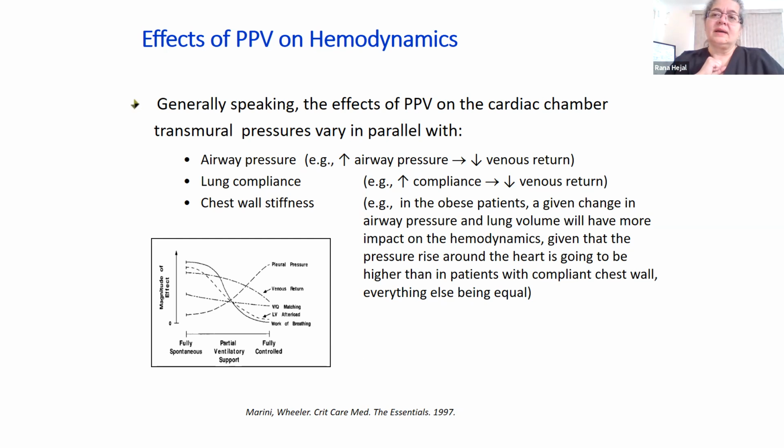Either they are feeling short of breath because the tube is in there and they are partially obstructed from it and they just are sighing constantly. So you want to take that out fast, and it's immaterial what you do with the ventilator. Or they are really not well yet. And in those settings, you have to reassess their mechanics. And if their mechanics are poor, then you sedate them again and you don't take them off the ventilator.